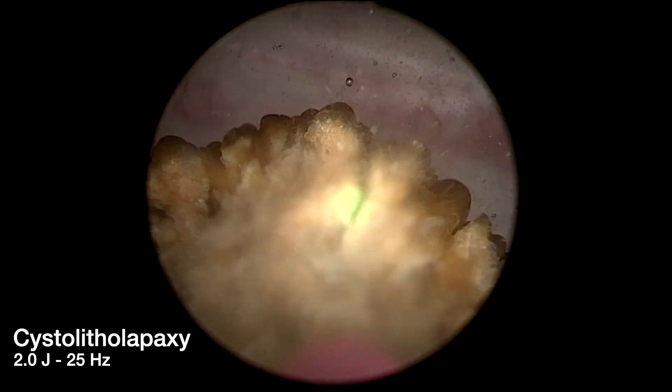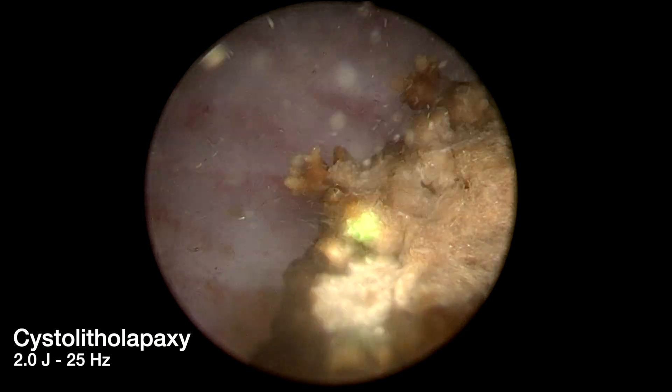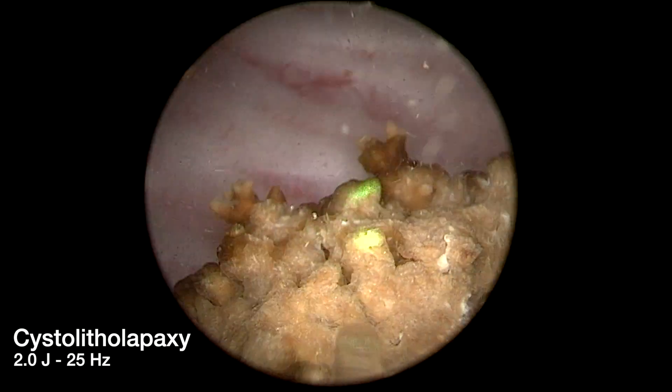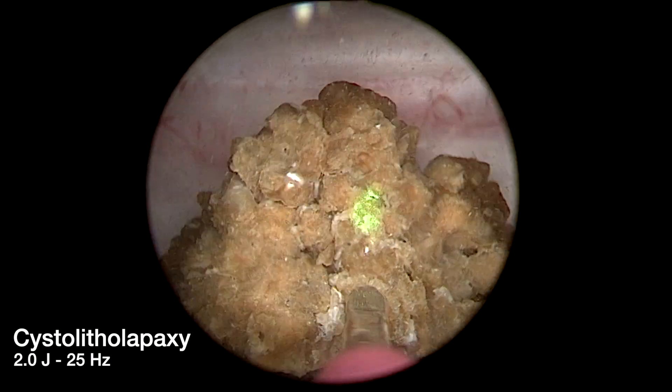We perform cystolithopaxi prior to prostate enucleation. In this sped-up segment, the holmium laser, set at 2 joules and 25 hertz, is used to dust the bladder stone. Smaller stones are stabilized against the bladder wall and are fragmented using brief laser bursts.